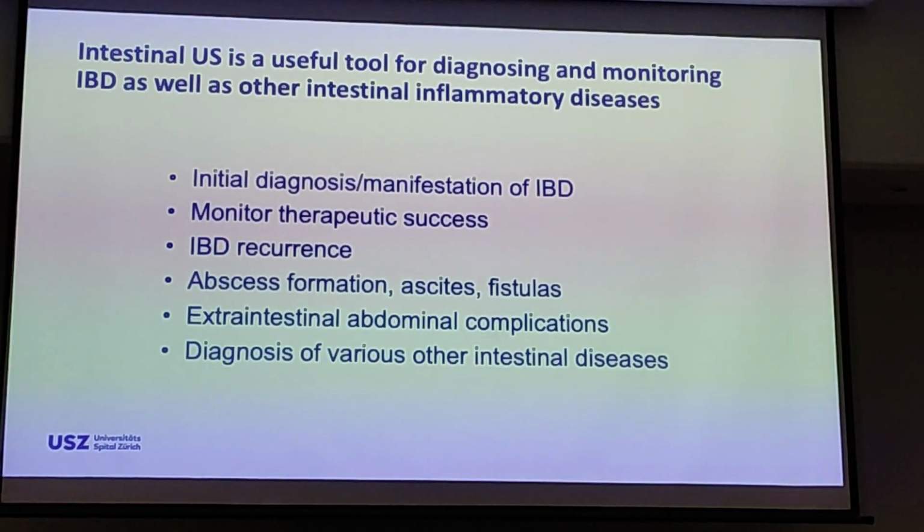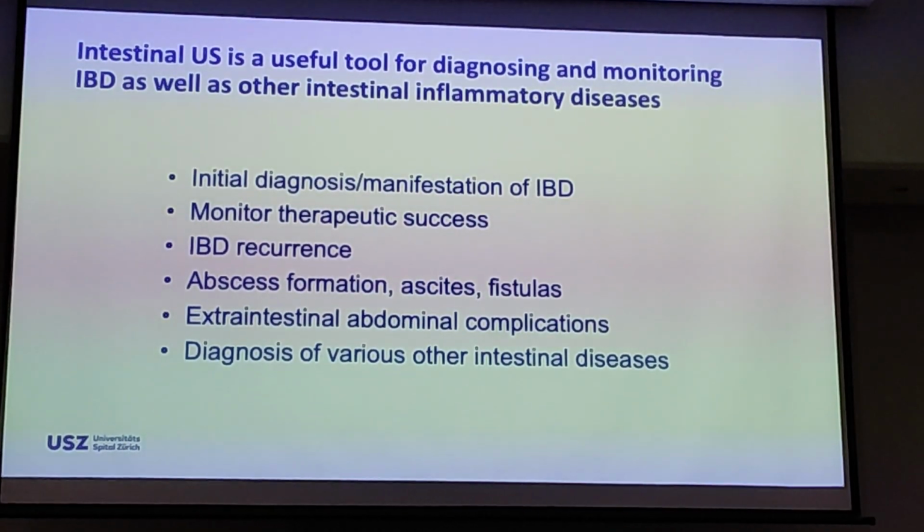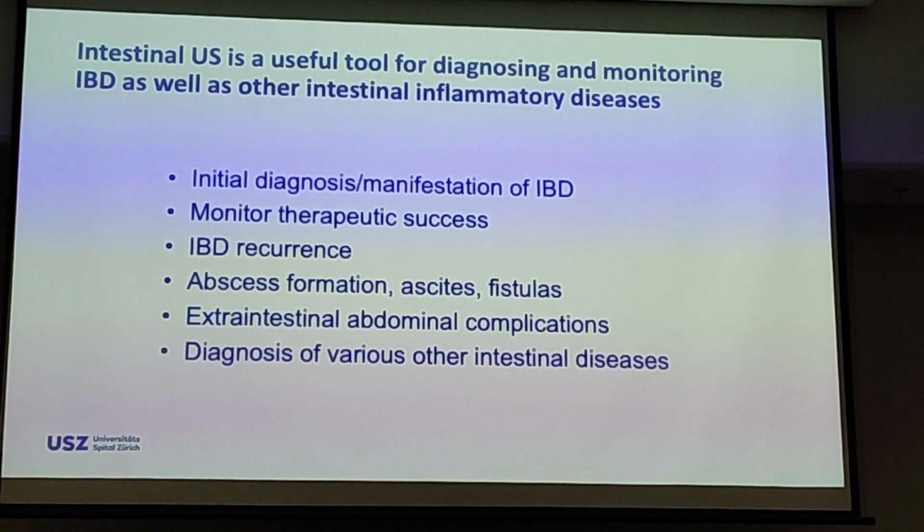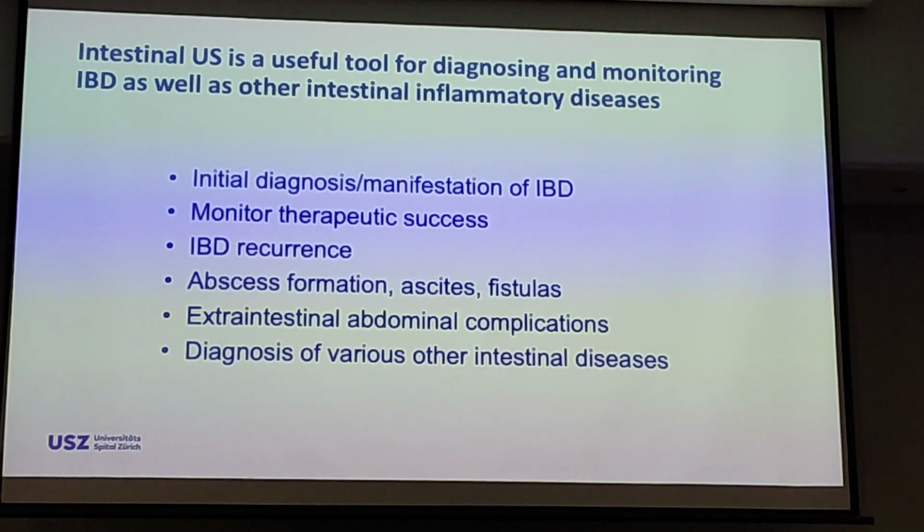So I would say intestinal ultrasound is a useful tool for diagnosis and monitoring of IBD as well as other intestinal inflammatory diseases, finding abscesses quickly, finding complications quickly, doing it right when you see the patient, with really low costs. You can make an initial diagnosis, monitor therapeutic success, see whether there's recurrence of the disease, see abscess formations, ascites, fistulas, extraintestinal abdominal complications, and of course diagnose various other intestinal diseases. So I would not want to work without it anymore.